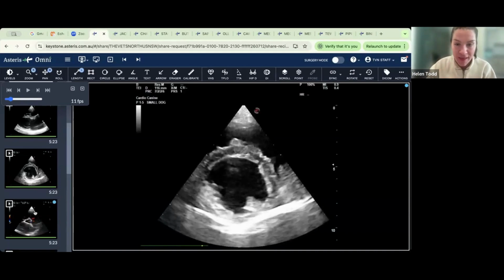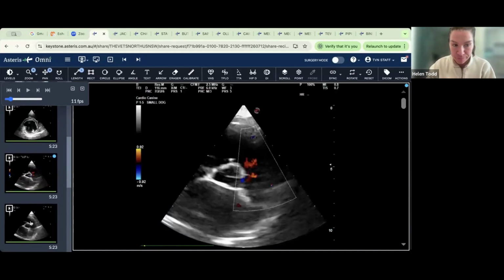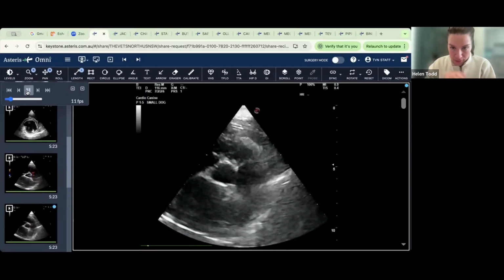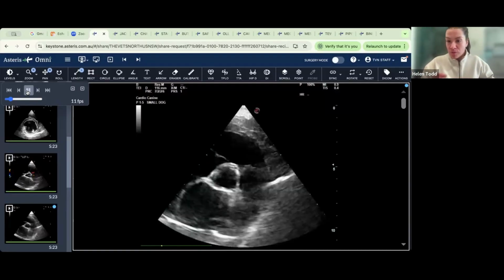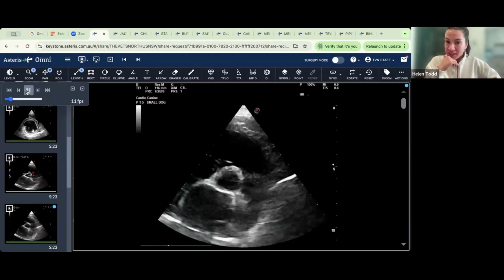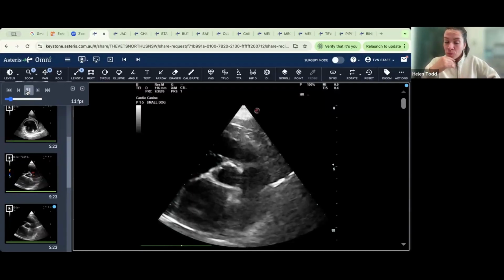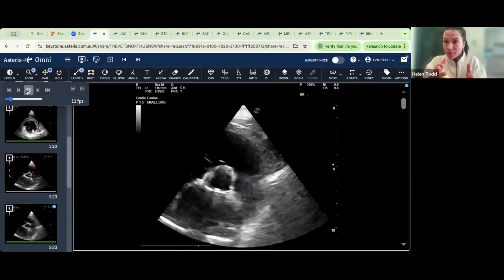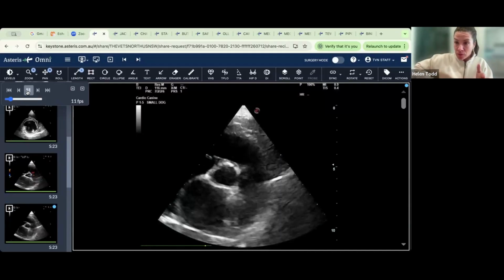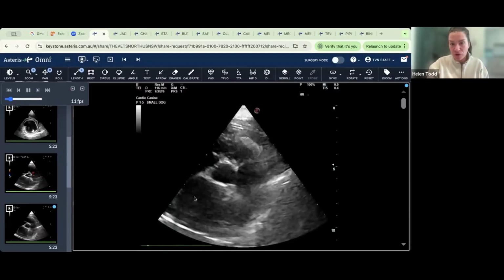And we're going to tilt from there into our LA AO view, which you can get a left atrium to aortic ratio in however you want. Is anyone doing it in practice, in sternal? When you're wanting to do a more thorough echo, it might look a little bit different than doing it with your patient in sternal, for example. But you're still going to tilt from this right side.